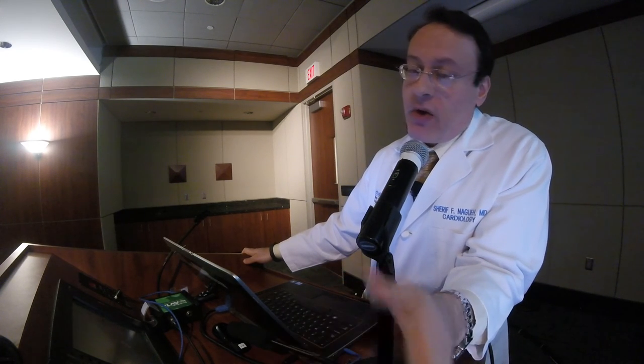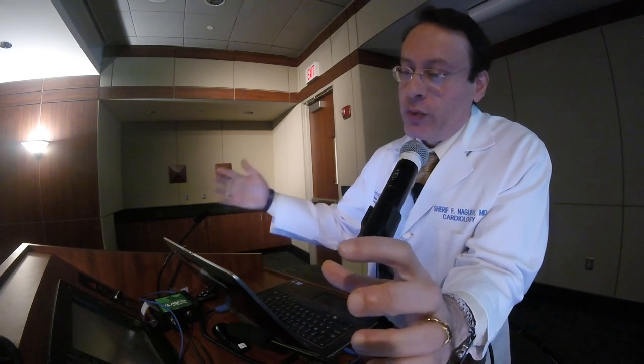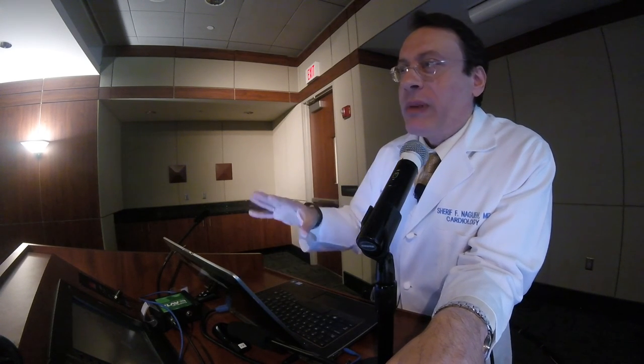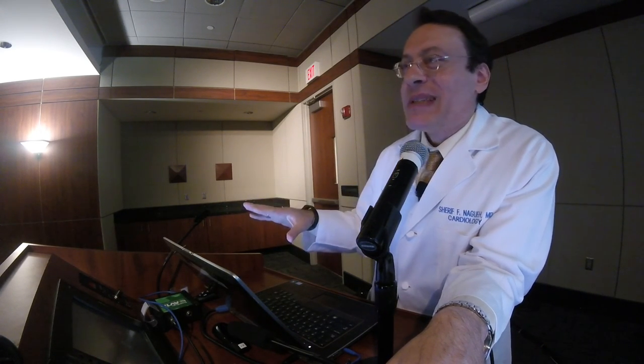And this is where a person needs to look at everything collectively. Sometimes you can, with discrepant data, arrive at a conclusion. Sometimes you cannot. The new guidelines will open the door for a situation where a report would come back indeterminate for LV filling pressures or indeterminate LV relaxation. So these will be allowed, yes. The problem, however, is many people sometimes will take the easier route.